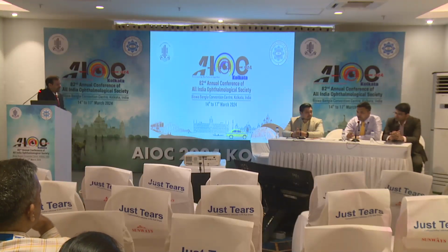Second question, sir, regarding the field of OCT angiography, you said that you prefer to do ultra wide field FFA. Now with Dream OCT being launched, it is giving us a 130-degree OCT angiography in a non-invasive way. Do you think it will change your practice, because now you have a 130-degree field OCT angiography? I still think I will go ahead with FFA at this moment.